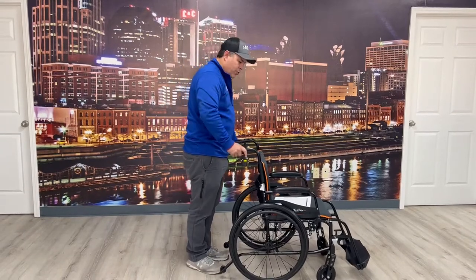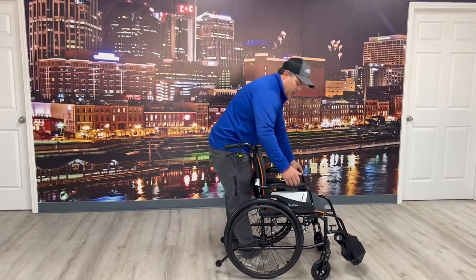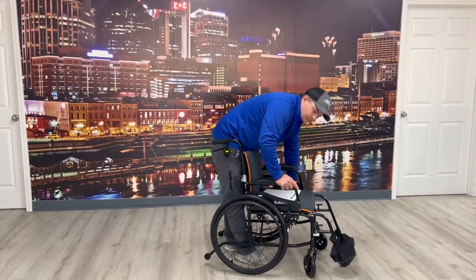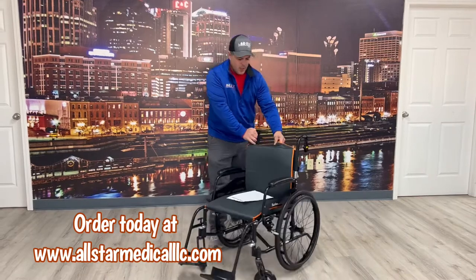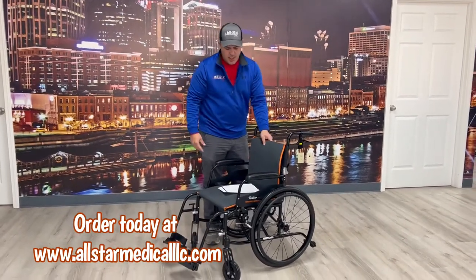It also has attendant brakes on the back, so you can squeeze or push down when somebody's getting in or out of the chair. The user can also operate these themselves, so you've got the best of both worlds — a really nice feature. The chair also comes with padding on the back and seat that can be removed and put back on.